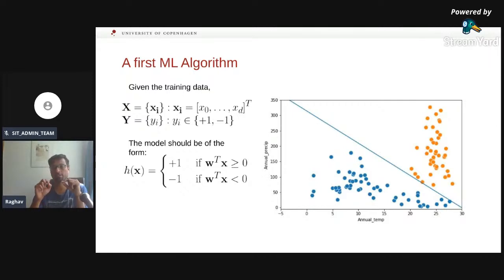You've learned what the specific W parameters should be. And then when you get new data, you try to see if it fits well or not. So this is the training phase and then the testing phase. What we're trying to figure out is where I should draw that straight line. We can see it visually, but how do we teach that to a model? By doing this algorithmically.